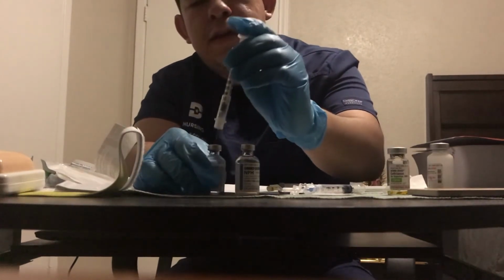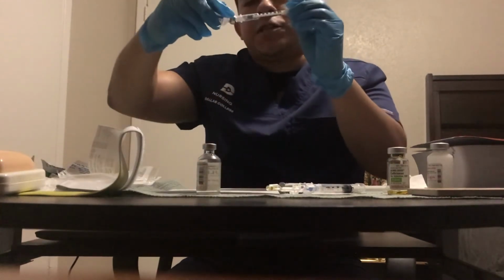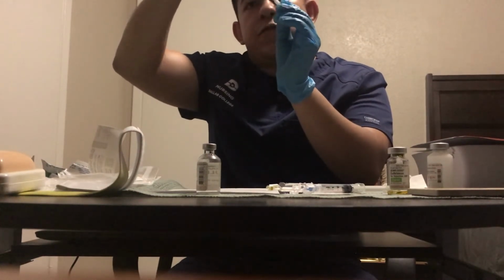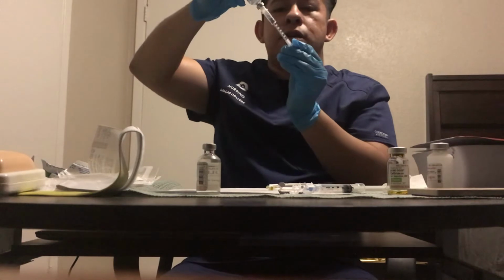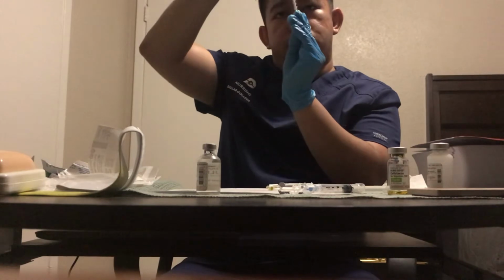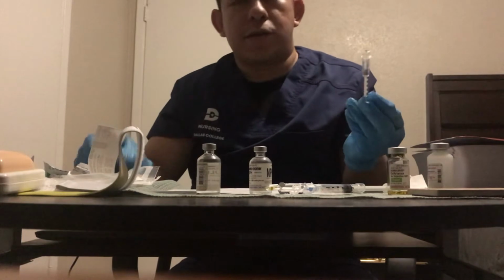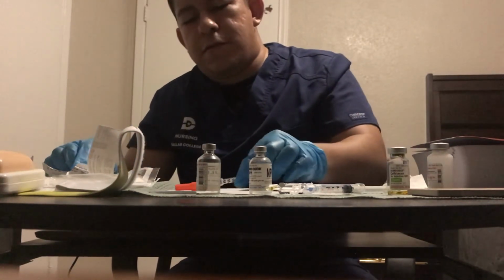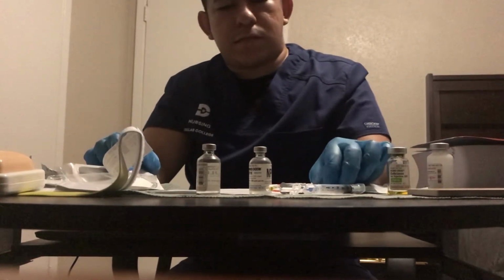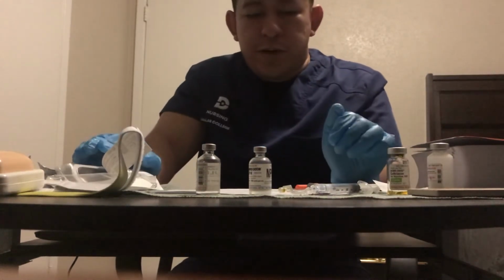So you have your 12 units, and then immediately draw up your 12 units of NPH now. And of course, you have to show, again, a second nurse that you are drawing up 12 units of NPH now. So we have a total of 24 units now. And then you immediately cap that using the scoop method. Okay. So we've done our second check for all our meds now.